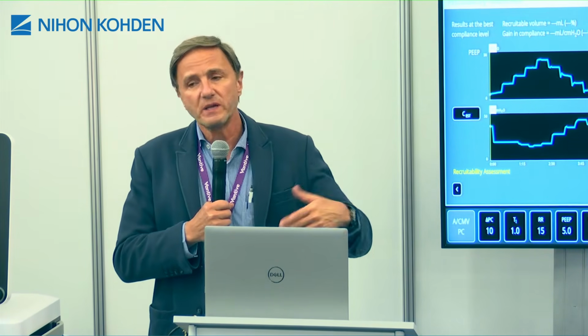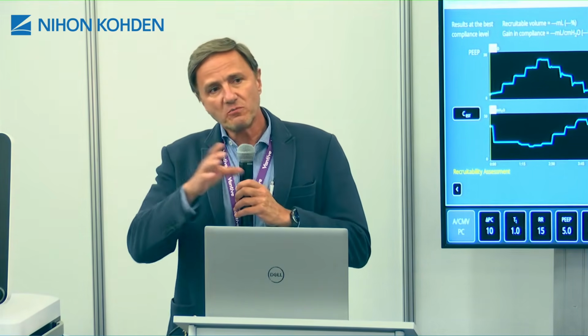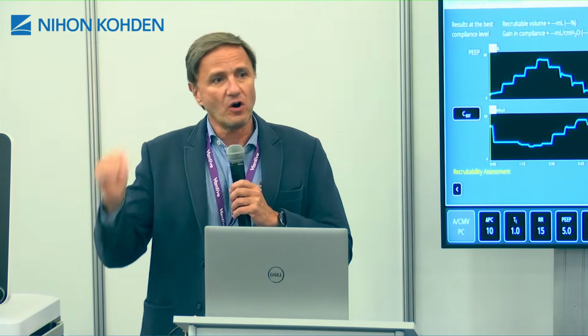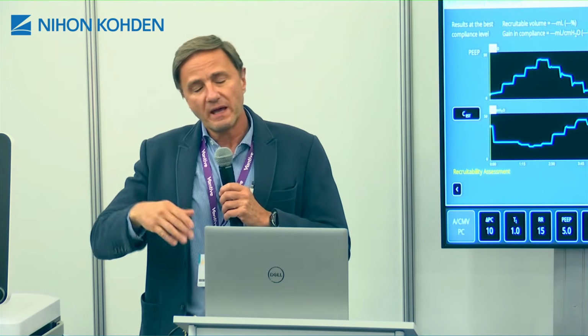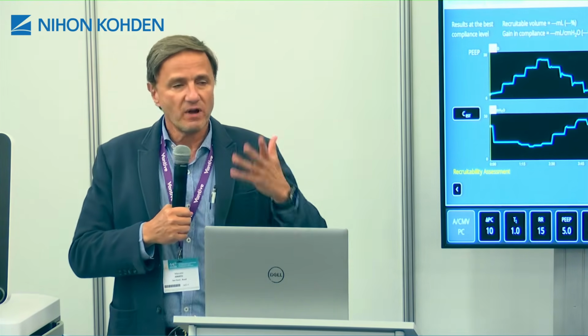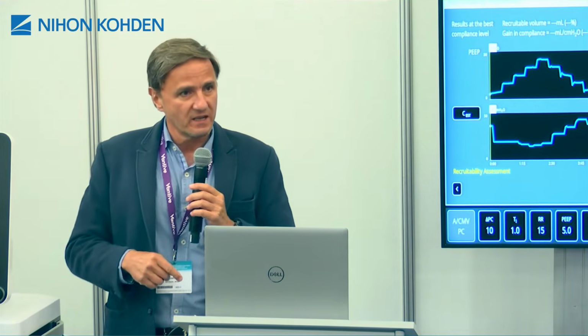For the first question, I would say just once, or if the patient is running to the second week, I would do it again to understand if this patient is still recruitable. And from CT studies, we know that recruitability is not an on-off, it's just a fading away. And many patients are still highly recruitable in the second week. So you have to test. And especially if the patient has a second hit, for instance a new infection, then you have to assess recruitability again because he can have lots of collapsed tissue.